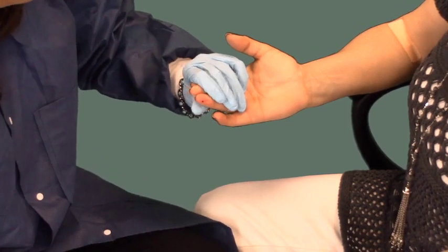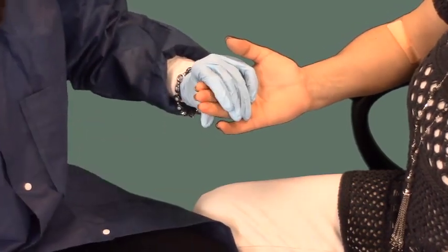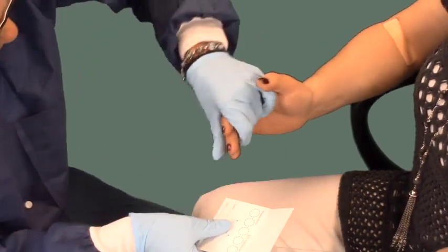Puncture the finger and wipe away the first droplet of blood. It is contaminated with alcohol and tissue fluid.